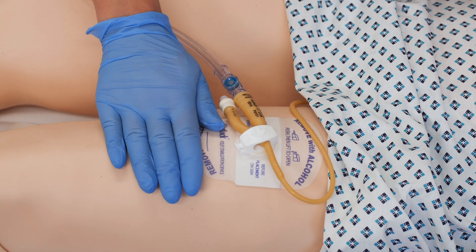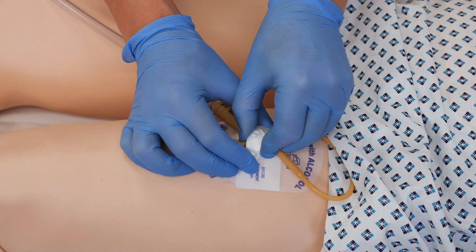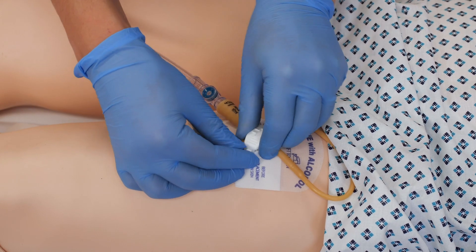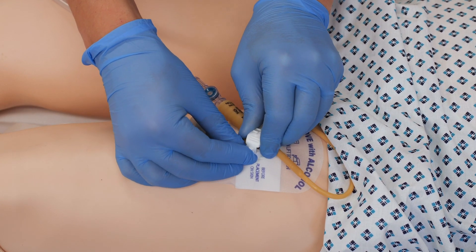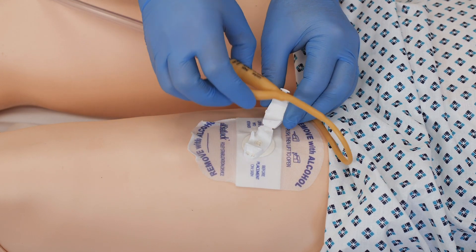Before removing the device, it needs to be released. This can be quite fiddly, but you press in and pull back at the same time and it opens to release the catheter.